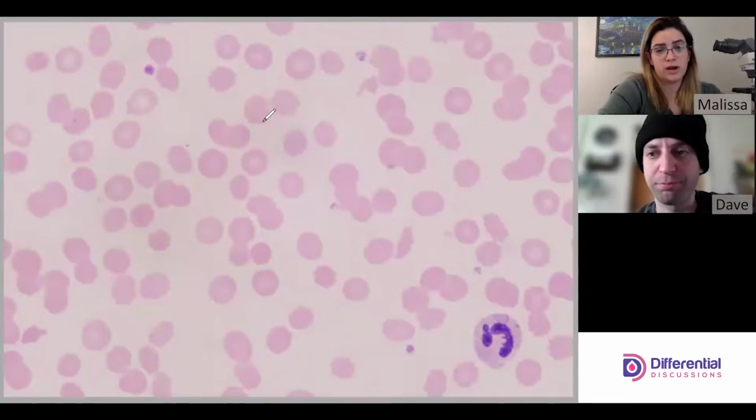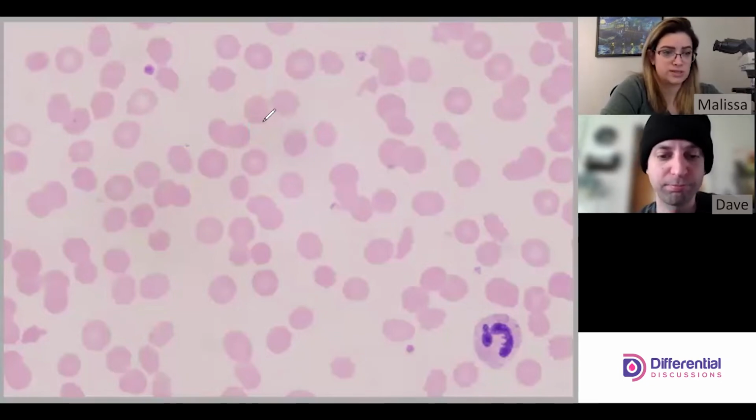Now, this depends on where and how much of your kidney is impacted. But if we're getting to the point where your BUN and creatinine are really elevated, then you probably have decreased EPO, because remember, the kidneys make EPO. So if you can't make EPO, you get decreased erythropoiesis. You're also going to have the possibility of anemia of chronic inflammation, because you have chronic inflammation from a damaged kidney.